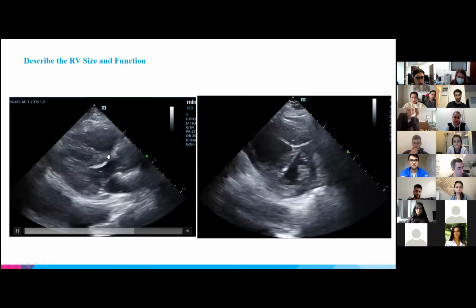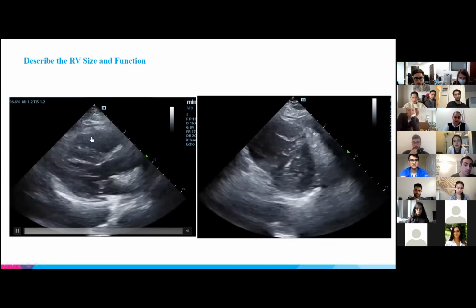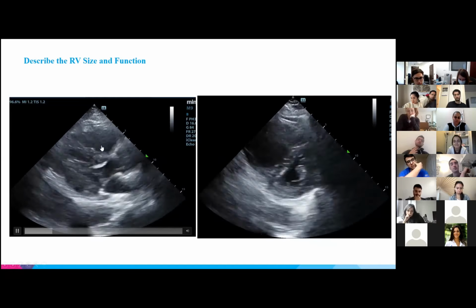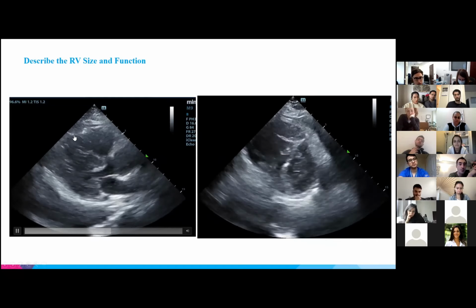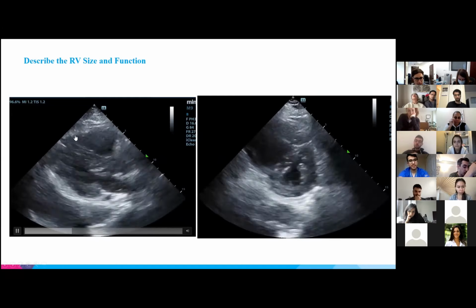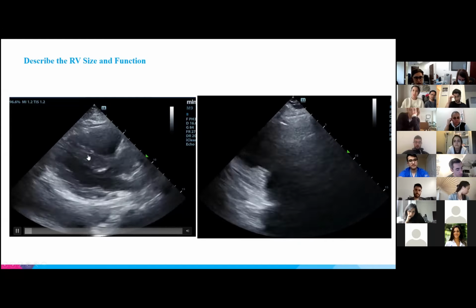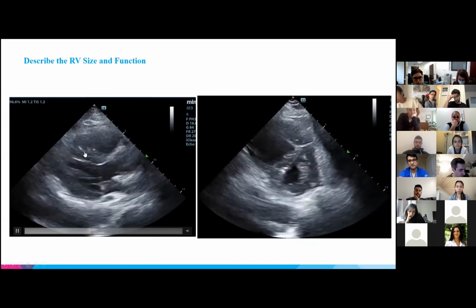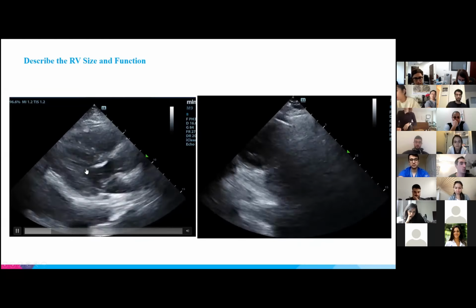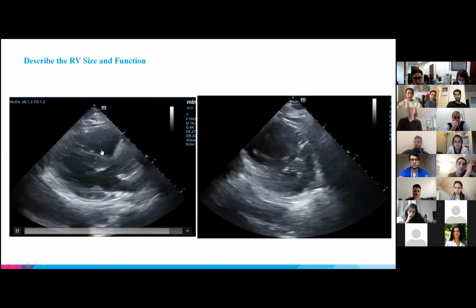So again we have your parasternal long view on the left. A very enlarged RV outflow tract here. Another tell is normally it should almost look like a little circle at top, but you see how the RV outflow tract goes all the way towards the LV apex here. So that's a very strange, unusual finding. There's also probably some pressure overload because the LV cavity almost looks small and hyperdynamic, and it disappears with contraction. So this is a patient that I'm already kind of worried about.